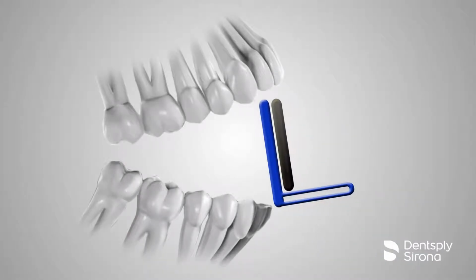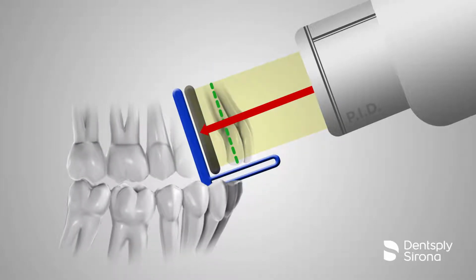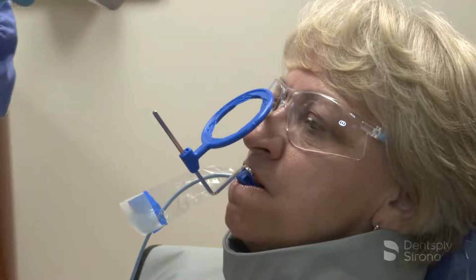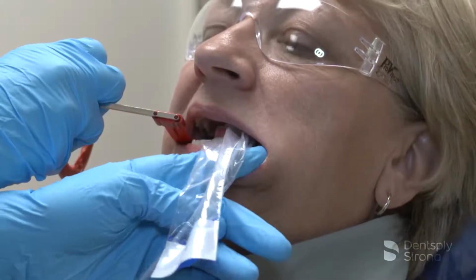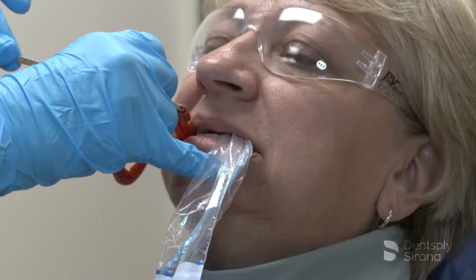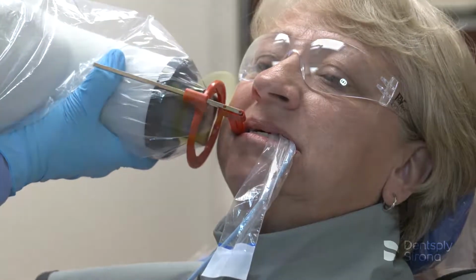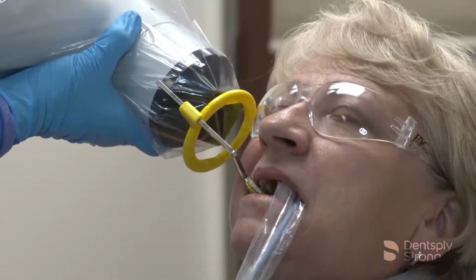The paralleling technique is used for both periapical and bite wing radiographs and is the most accurate technique for taking these projections. Receptor instruments with X-ray beam ring guides improve the accuracy of the PID alignment to ensure correct beam angulation and centering. Receptor instruments combine a receptor holder with an arm that has an attached ring indicating the position for the PID. This helps the operator avoid cone cut errors by specifically directing the X-ray beam toward the center of the receptor.